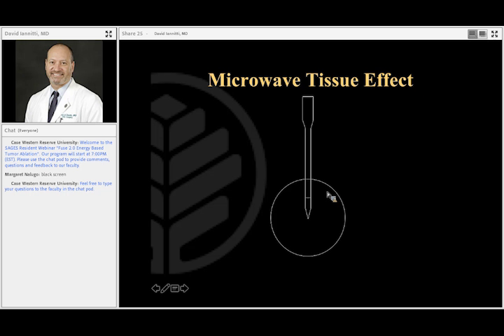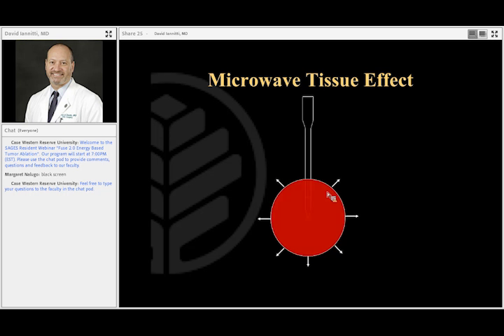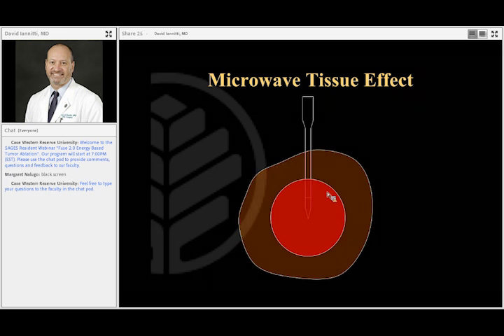So as you start putting power into this microwave near field, you start creating this thermal mass, this thermal sphere that's evenly heated up, regardless of what's in there. If your hand is in there with a glove on, you're going to heat up your hand. And so that microwave near field is heated up through radiation. Nothing affects that, nothing. And then as you create this thermal mass, that thermal mass outside of the microwave near field is going to heat up the tissue around it, just like radio frequency ablation, and that's going to give you the outer zone or the conductive zone, which can be susceptible to thermal sinks.